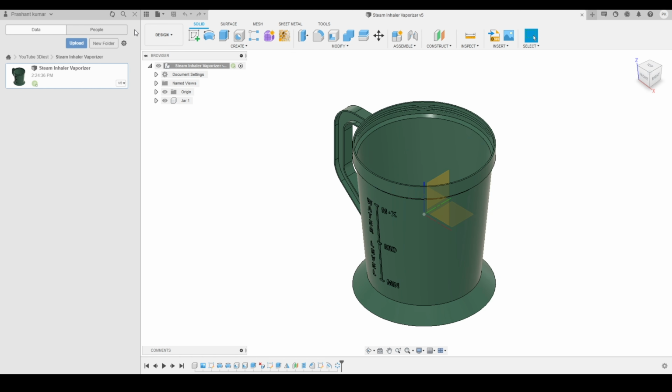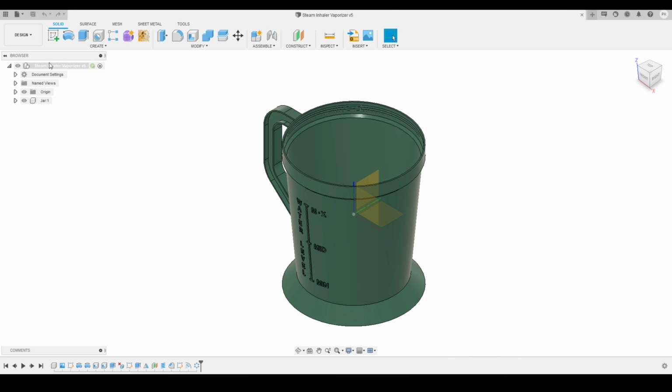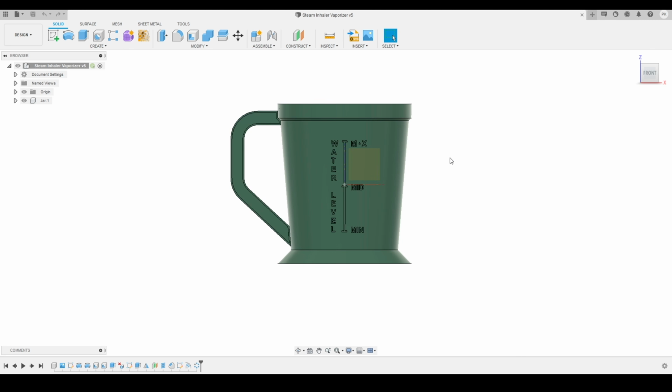Here you can see, in our last class we had modeled this jar component. This is the jar that we had prepared in our last part. We'll move forward, we will turn off the origin, and here you can see this is our jar component that we had prepared in our last tutorial.